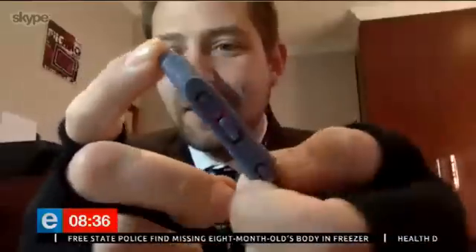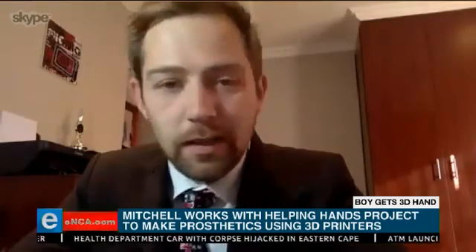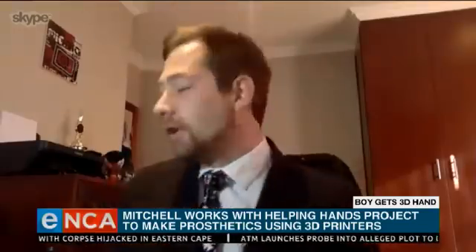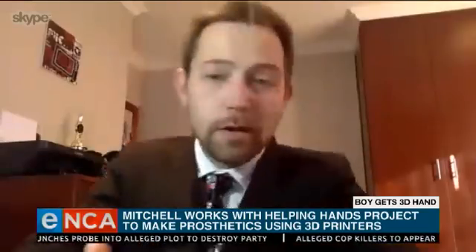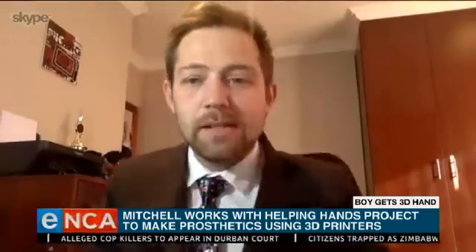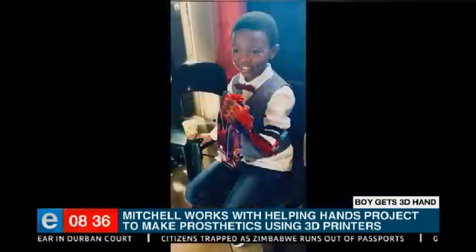Tell me about the Spider-Man theme though — is that what he asked you for? Yes. On the Easter weekend I had a Skype meeting with Apelele and his family and his teachers, and we got a bunch of measurements. I asked him what theme he really liked and he said he absolutely loves Spider-Man and Superman, and me myself also being a massive Spider-Man fan, I decided I'm going to go really crazy into this.